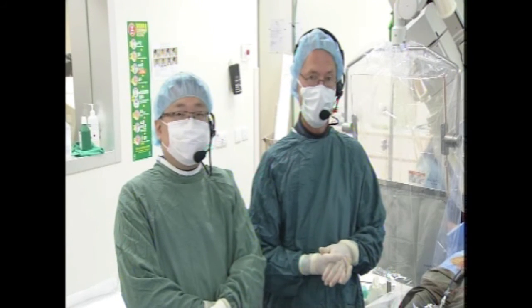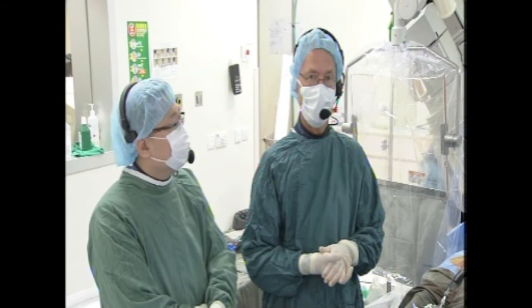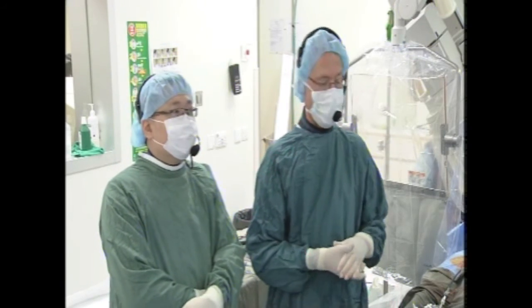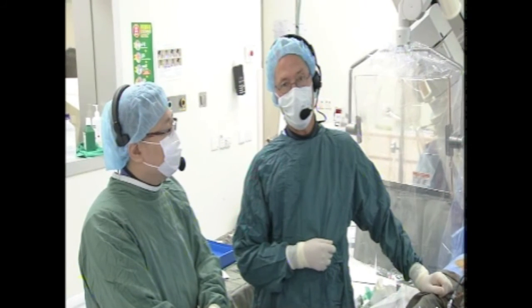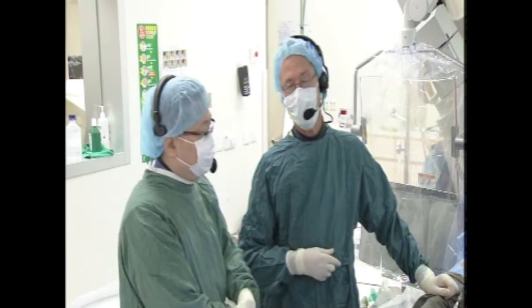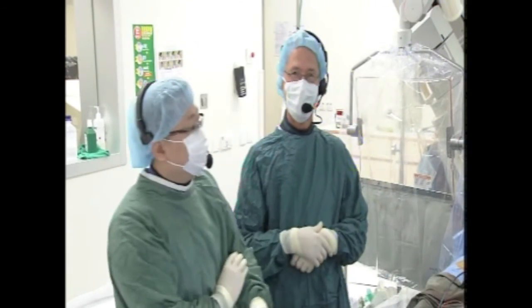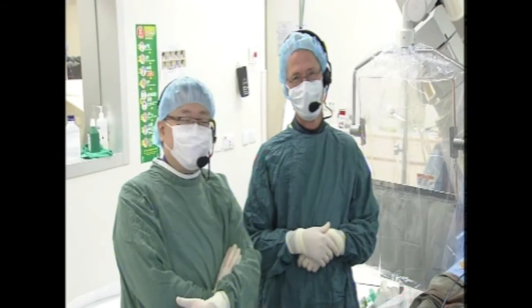All right. For this oval orifice, is the other device better? You were asking what device to use. Is the ACP better? Oh, I don't have data, but I think both devices are okay for that situation. I think the devices are good, but the appendages are not good. So I think it's not a major difference. That's right. That's a very fair answer.